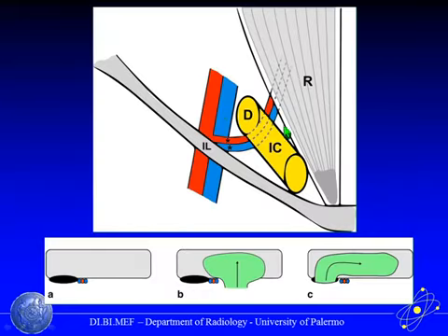So this is a schematic about the inguinal hernias. So femoral vessels, inferior epigastric vessels arising from the femoral vessels. This is the inguinal ligament. This is the rectus abdominis, and this is the inguinal canal with deep ring and superficial ring. This is in this schematic.